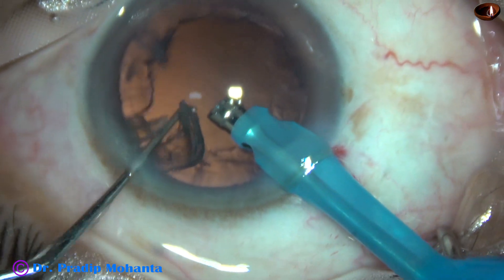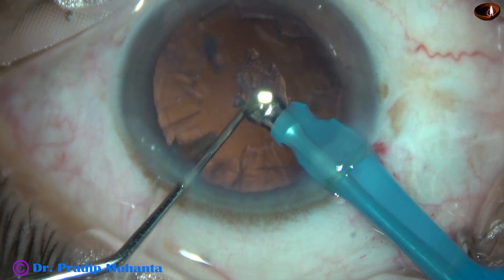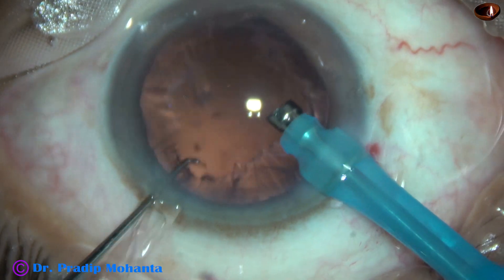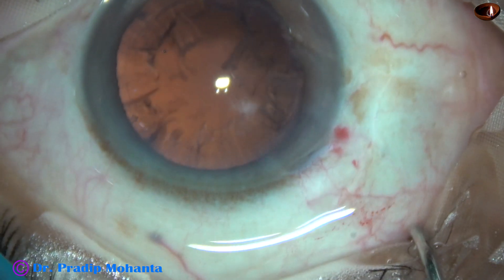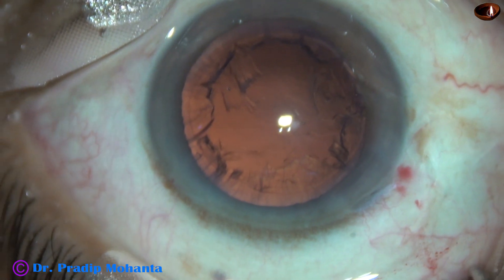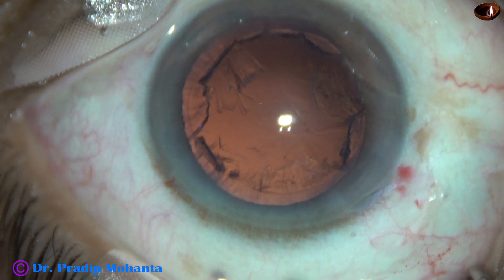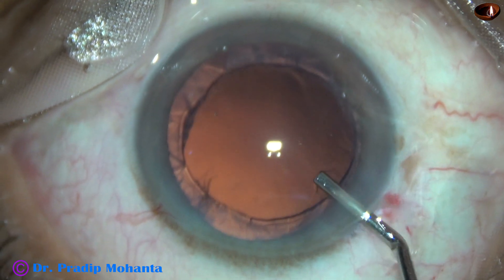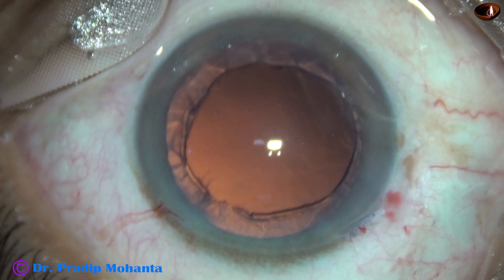In this case, I supported the posterior capsule with the chopper. Now I have to clean this cortex. I have made only one side port, and my idea is to use a 23G Simcoe cannula to clean the cortex.